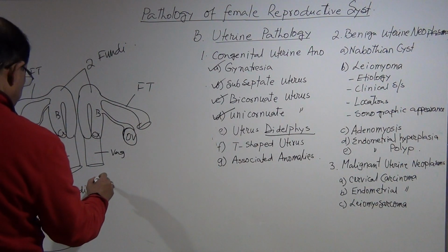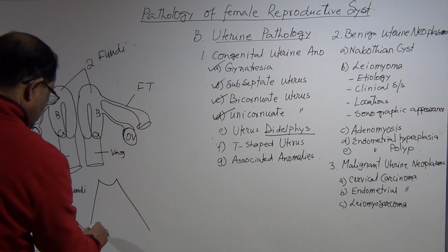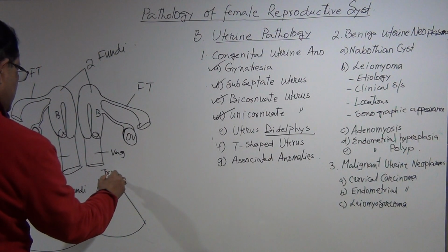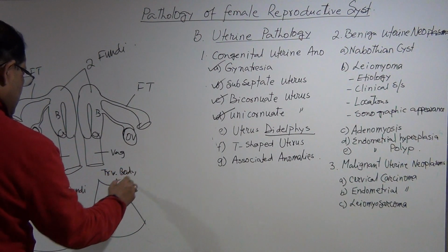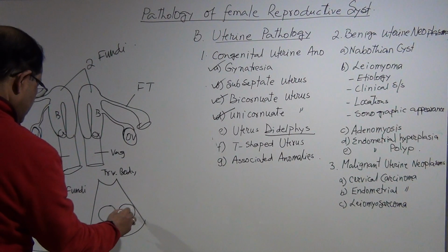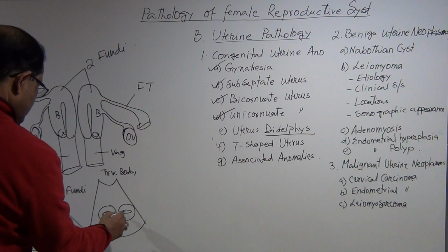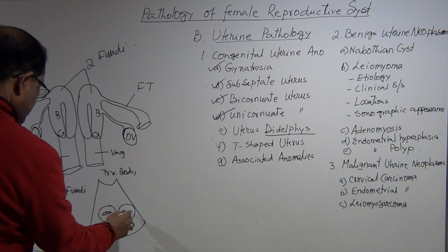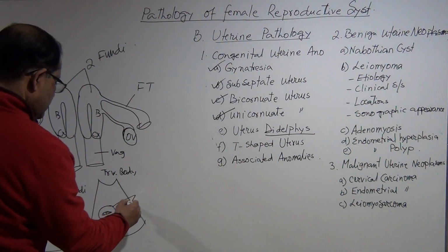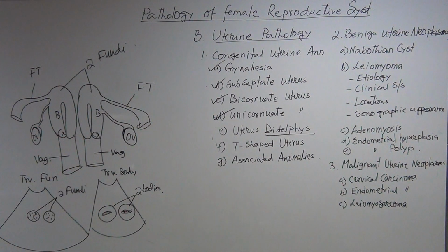Then you will see the transverse body, there will be two bodies.